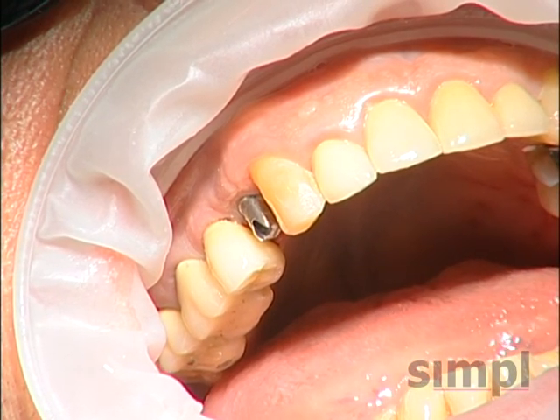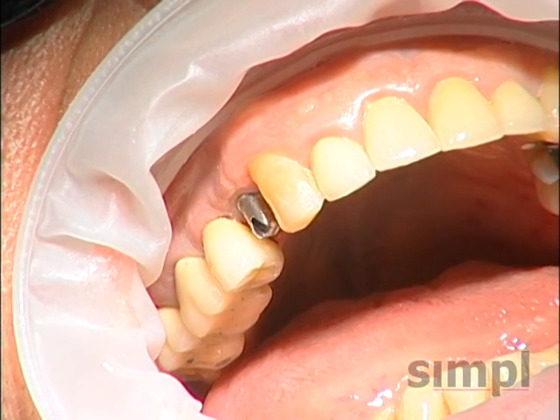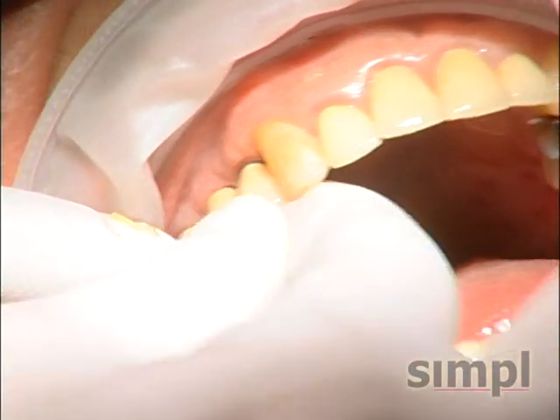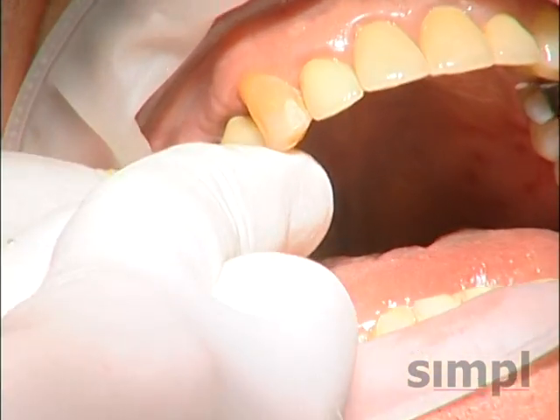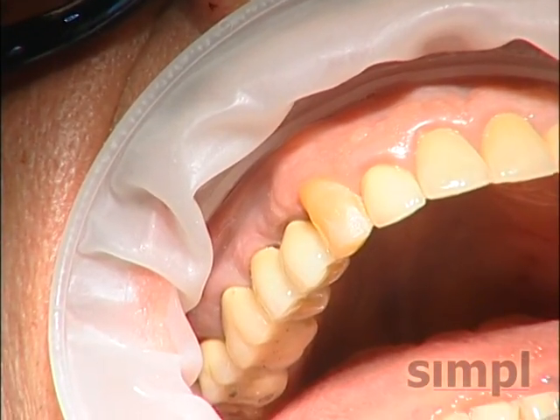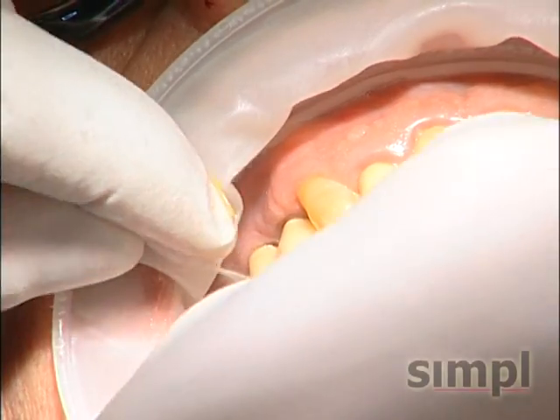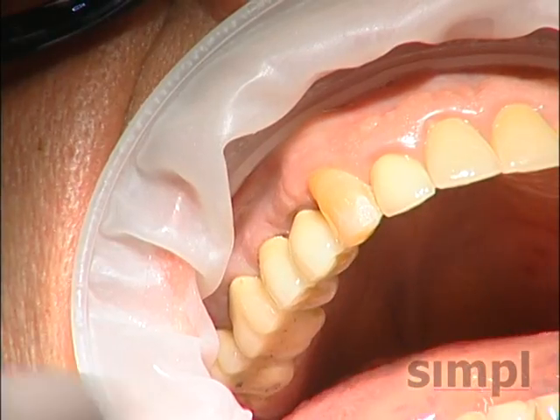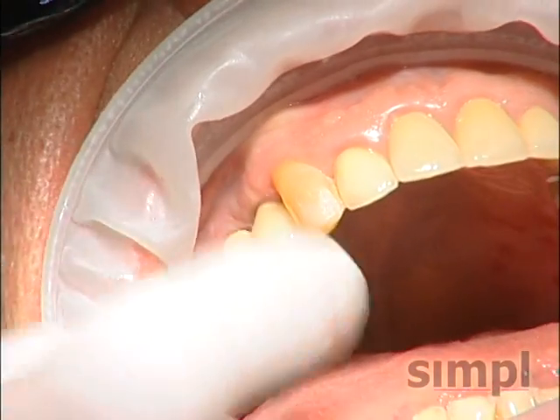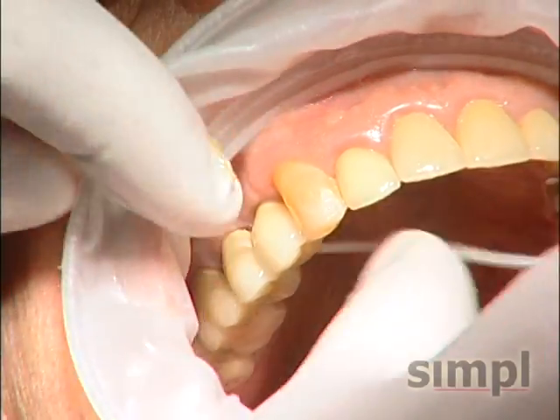We are now going to try the crown. In. And we're pushing the crown in. The contact field may be a little snug. We're going to check that with floss. Okay. And we get the floss in with some resistance.